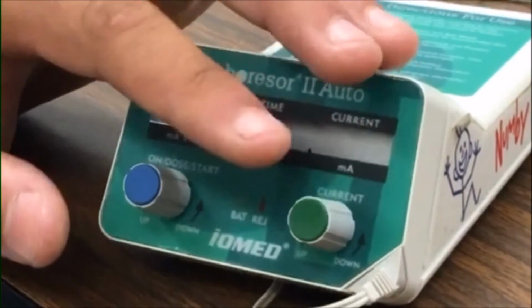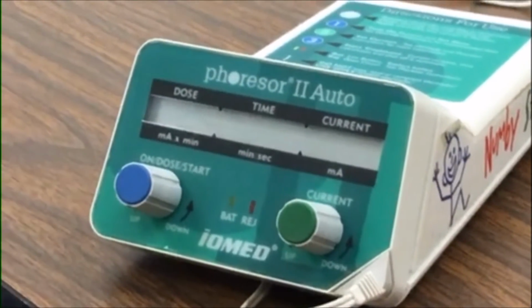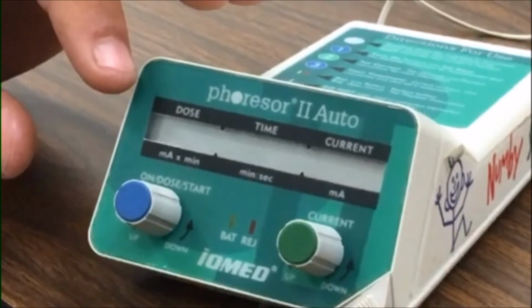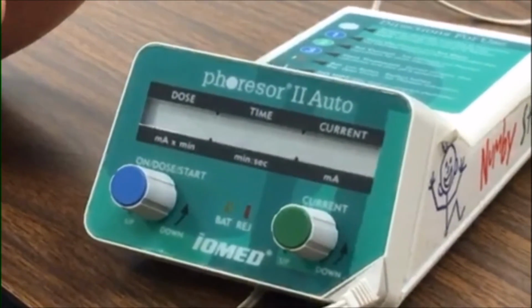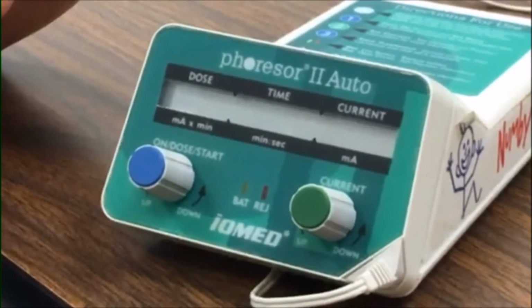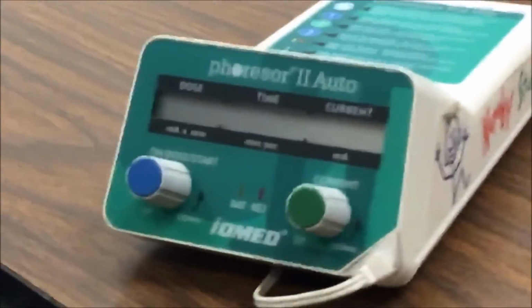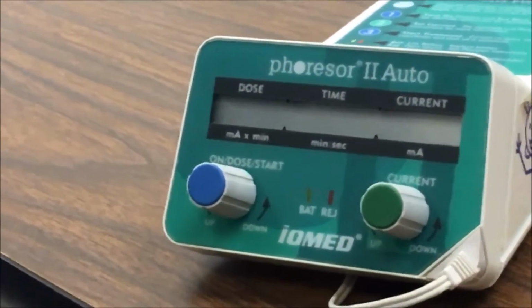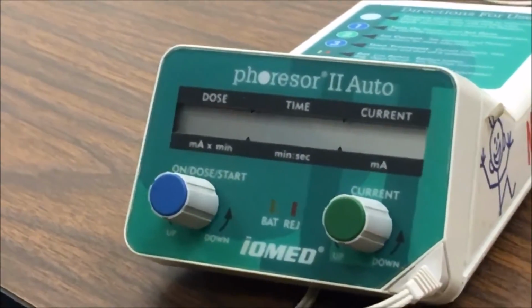For example, using a 4 milliamp current, which would be this one, will mean a treatment time of 10 minutes to achieve 40 milliamp minutes. But if we use a 2 milliamp current, our treatment time will increase to 20 minutes to achieve 40 milliamp minutes. Ultimately, we as clinicians want to deliver all of the medication prescribed in the shortest amount of time possible, as long as the 40 milliamp minute dosage level is achieved.